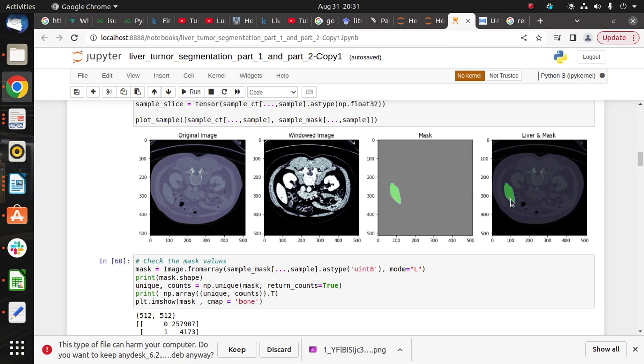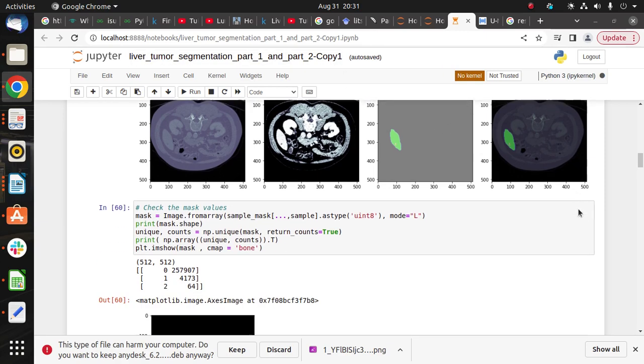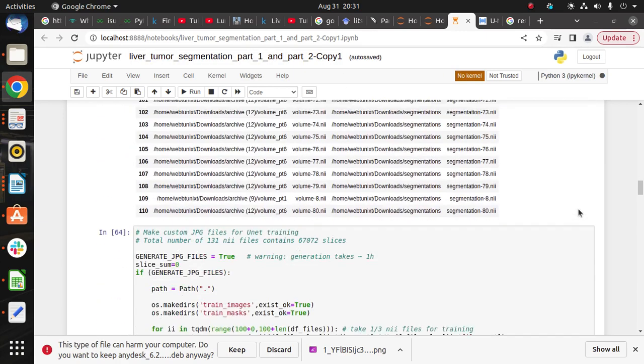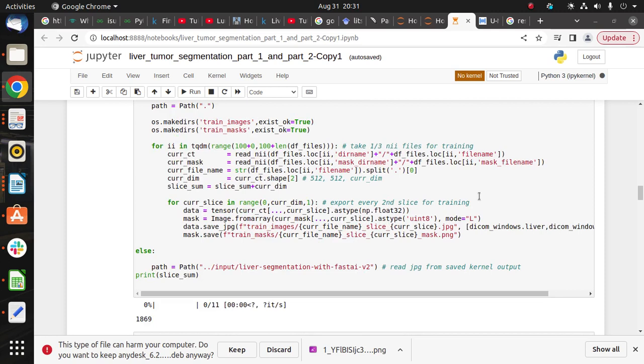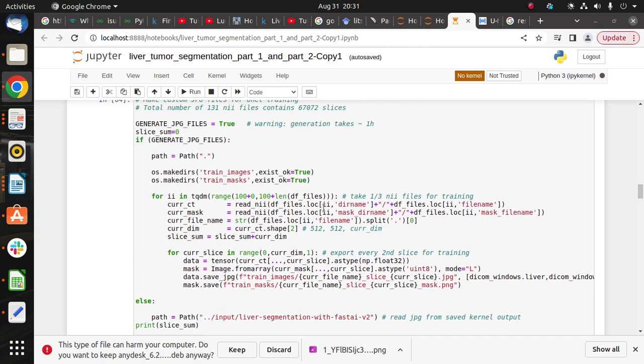After that, we create a custom JPG file for the model training. For training we have 131 nii files.